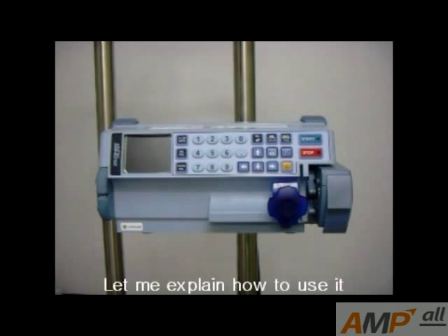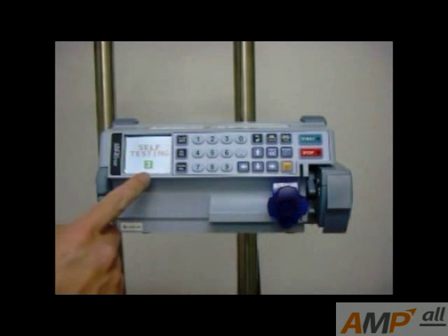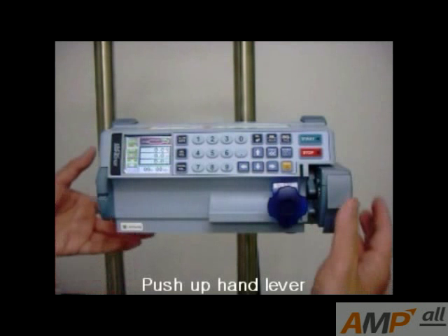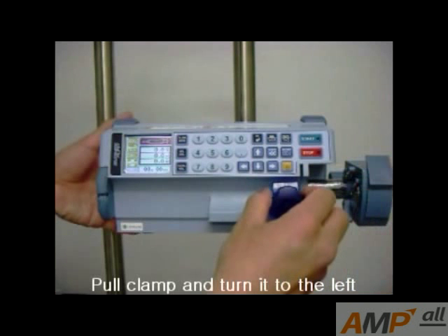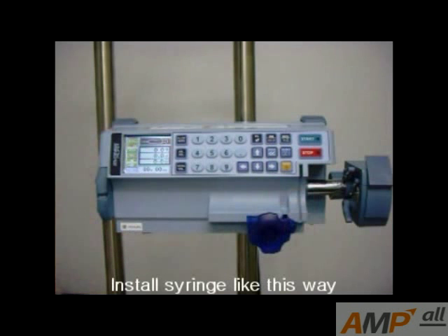Let me explain how to use it. Press the power button. Self-testing works for 3 seconds. Push up the hand lever. Pull the slide to the right. Pull the clamp and turn it to the left. Install the syringe like this.